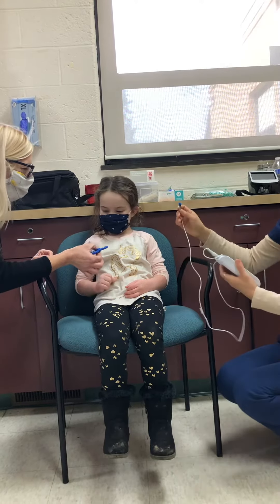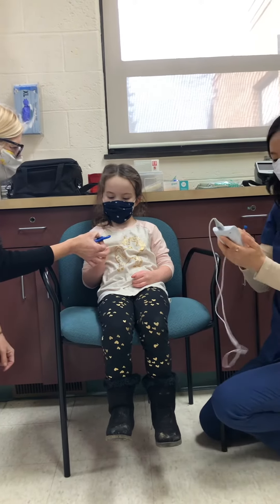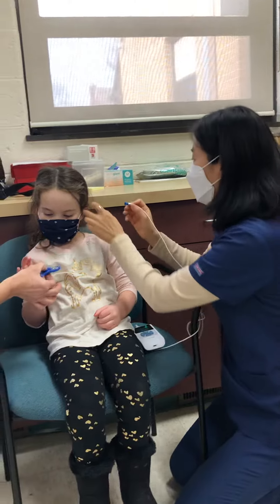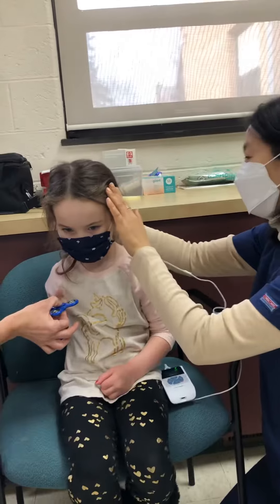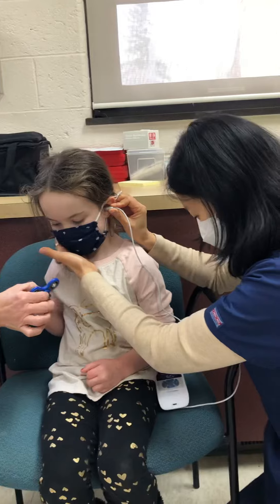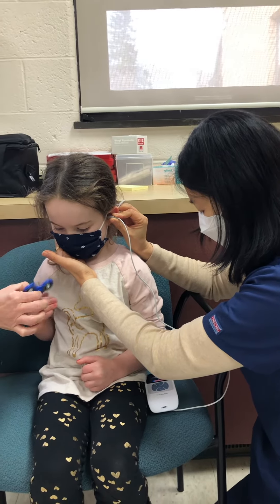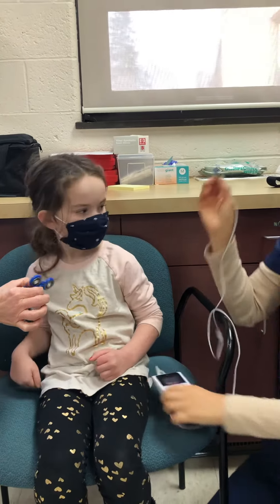All right, we can go ahead and give it a go. You ready? Okay, so nurse Connie is turning on the computer. Selena, would you sit up a little bit? Thank you. And give it your hand.